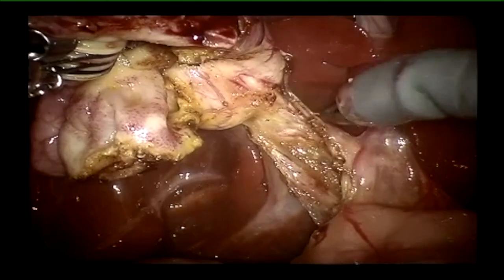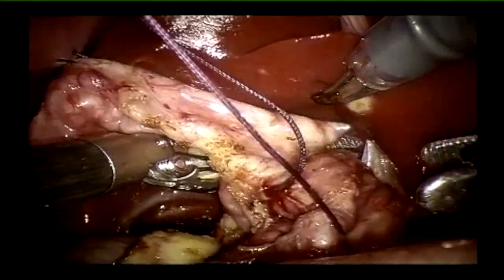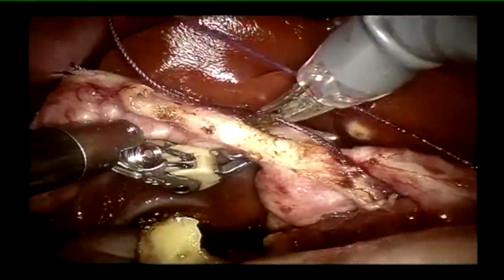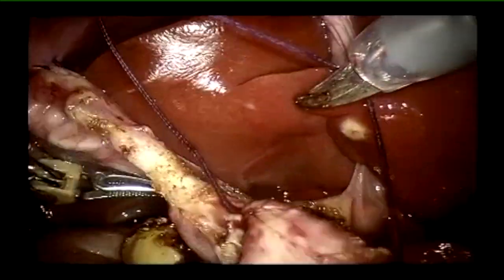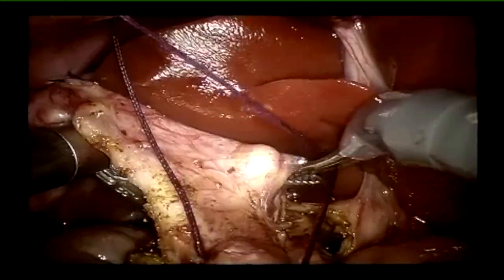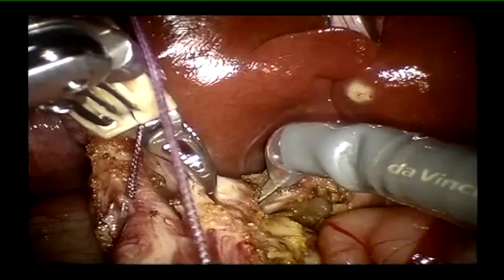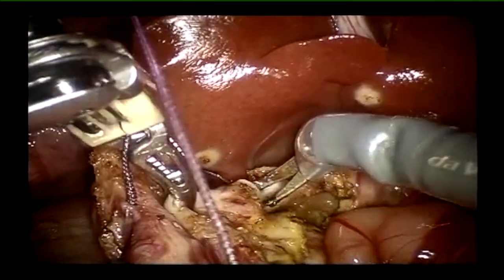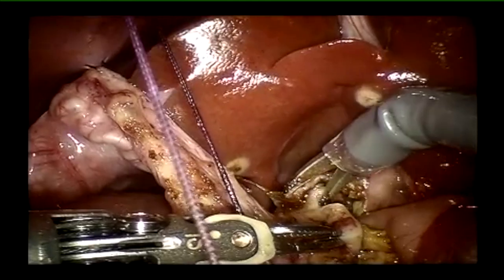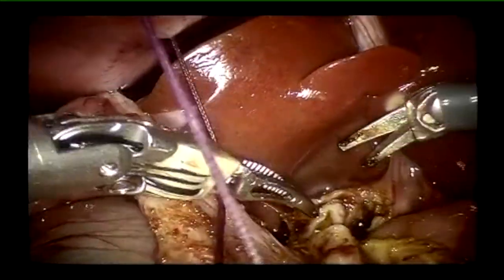That narrowing should be the endpoint of your dissection. Remain close to the cyst at all times. Maintain constant communication with your anesthetist — we start with a pressure of about 10 mmHg but bring it down to as low as 6 once the ports are in and the abdomen is sufficiently distended. Here I am defining Calot's triangle, because with a huge cyst and distorted anatomy, we need to confirm our landmarks before cutting the common hepatic duct.